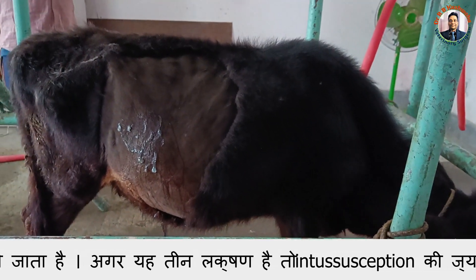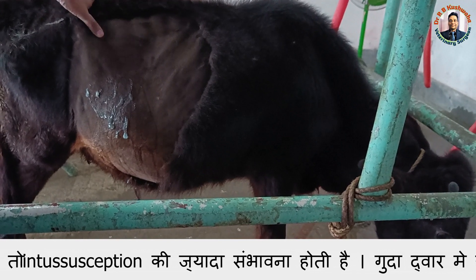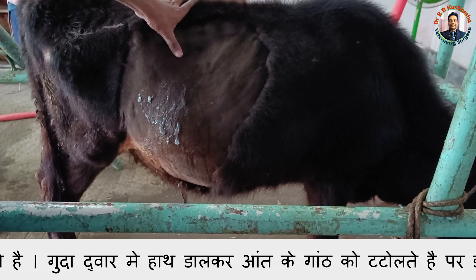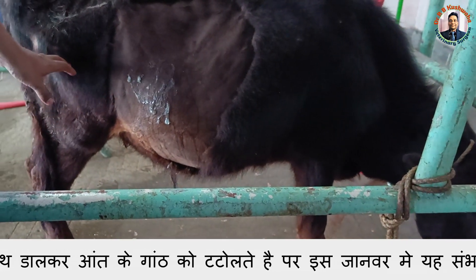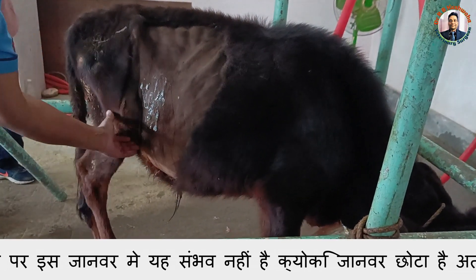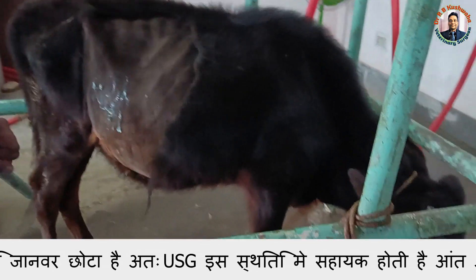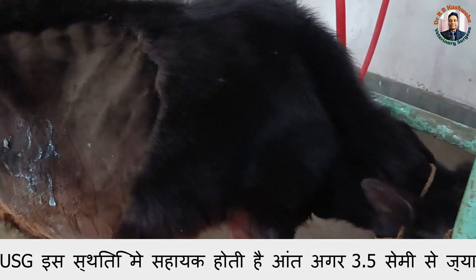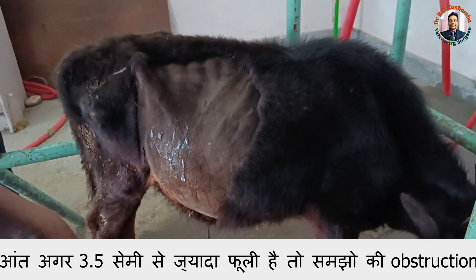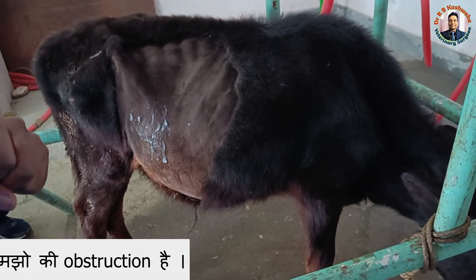The next procedure is right flank laparotomy to identify the intussusception mass. You may ask why the intussusception mass was not scanned. Because the intussusception is very difficult to identify — whether it is located near the pelvic brim or at the ventral aspect. In small animals, intussusception normally appears as a target-like or bull's-eye pattern. But here, because of the voluminous abdomen, it is very difficult to scan exactly. Based on the distended loops of intestine suggestive of intestinal obstruction, we diagnosed the case as intussusception.